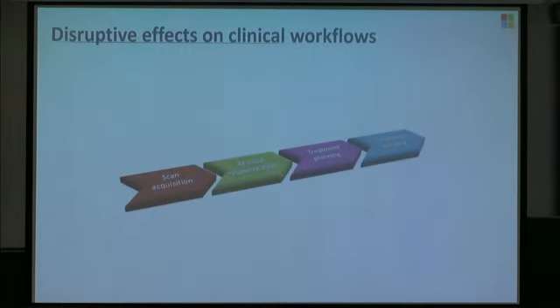So these kinds of technologies are quite interesting because they can disrupt our traditional clinical workflow. Our clinical workflow at the moment is very simple. We acquire scans. We sit there on computers in darkened rooms and we draw around all of the structures that are important to plan radiotherapy treatments. We then go ahead and do the treatment planning, which is actually highly automated. It's effectively all numerical optimization. And then we deliver the treatment.